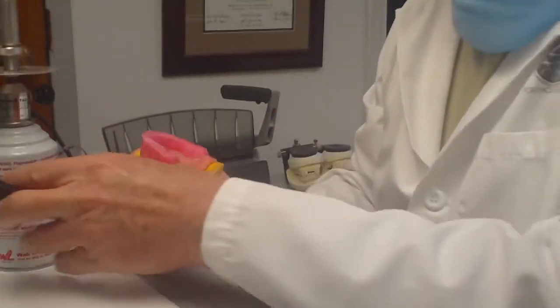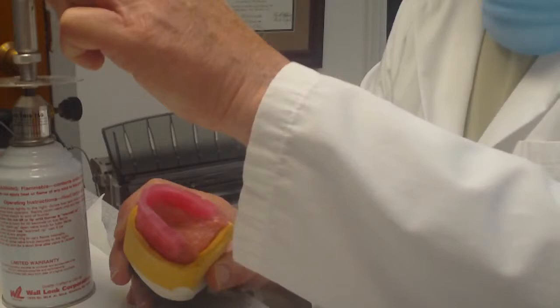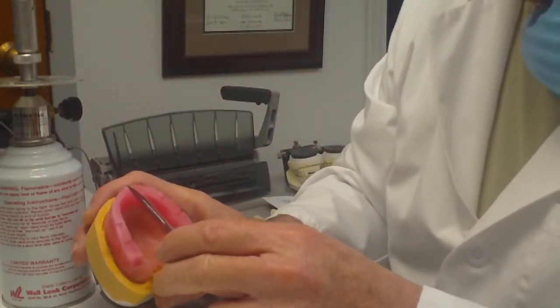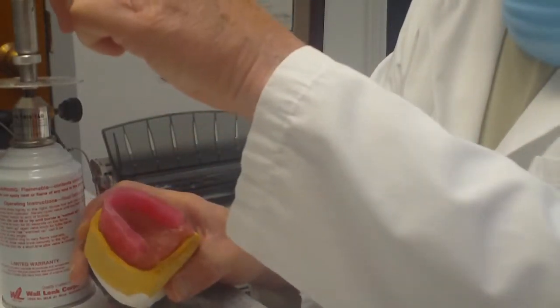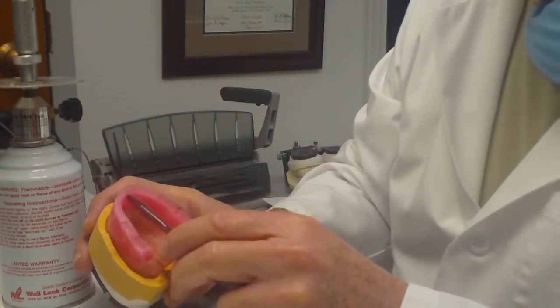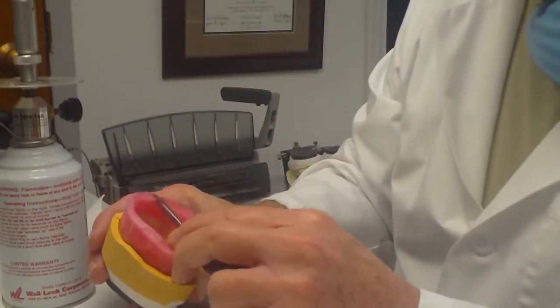What I'm going to do is heat up a Bard Parker, a 25 blade Bard Parker, and warm it up, and I'm going to take a section out of this maxillary occlusion rim and start setting the denture teeth. Again, the occlusion rim is going to be our guide, but we need to make some space for tooth positioning. And so I guess you'd have to say, as we do this, we're making some guesstimations based on the appearance of the occlusion rim that hasn't been removed yet, because we're going to set these teeth with symmetry in mind.